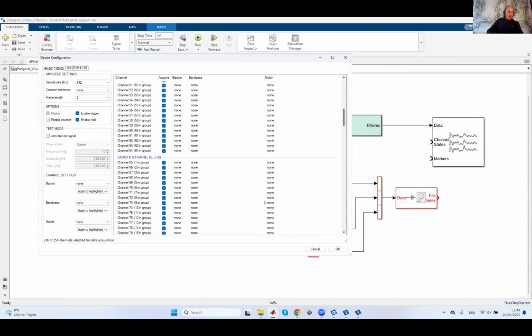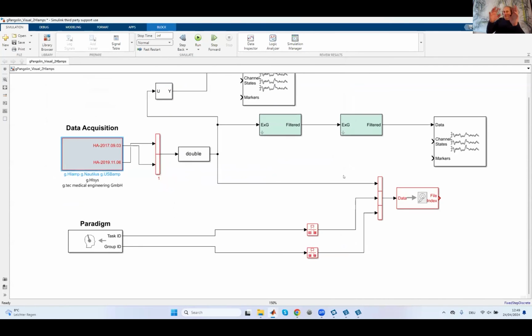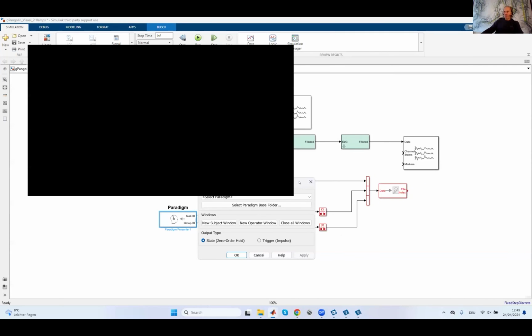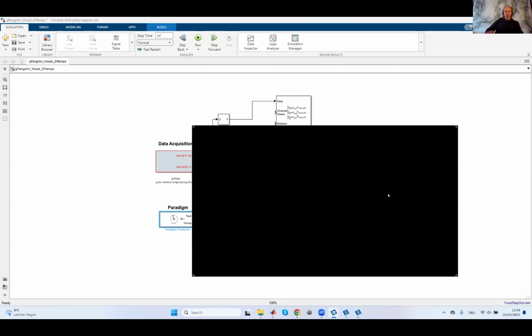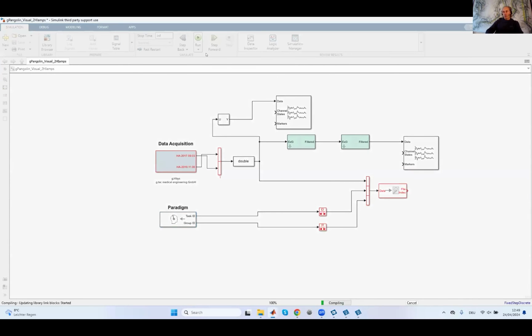And of course, the electrodes must be super flexible, because Patrick has a pretty round head, like everybody. They have to attach perfectly to the head. If the material were stiff, it wouldn't align well, and we wouldn't have a solid contact, which is super important. So we use adhesives which are very sticky on the skin side to mount it carefully.